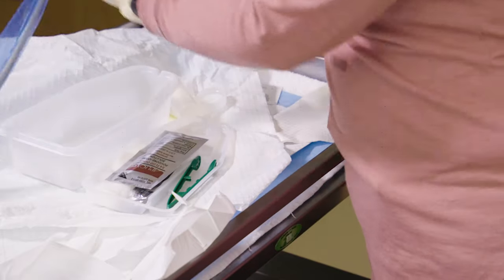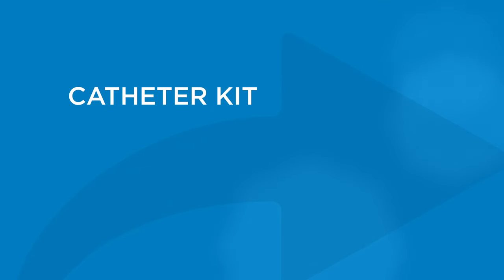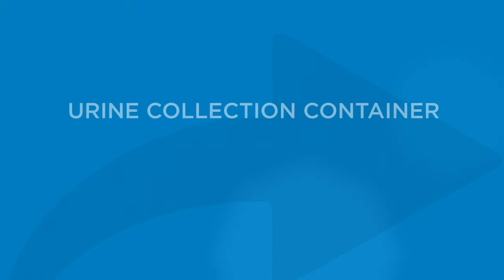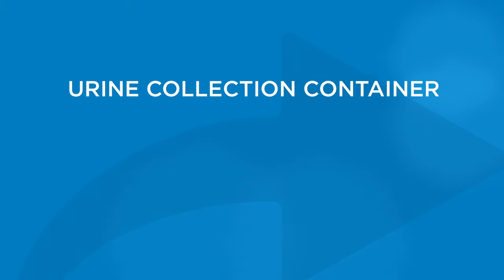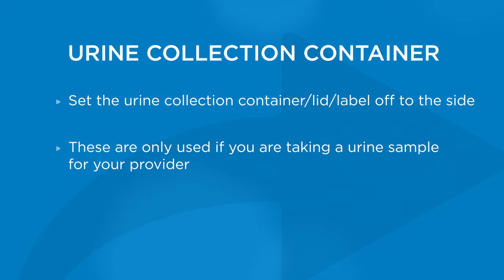Remove the lid of the tray and place the lid directly in front of the tray on your clean work area. When you remove the lid, you'll see a urine collection cup, a lid, a label, and a filled syringe. Remove everything except for the syringe. Set the urine collection container and label off to the side. These will only be used if obtaining a urine sample for your provider.